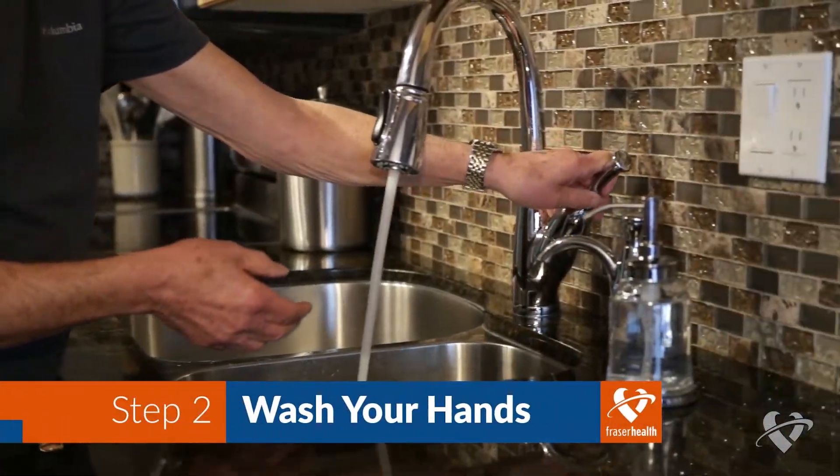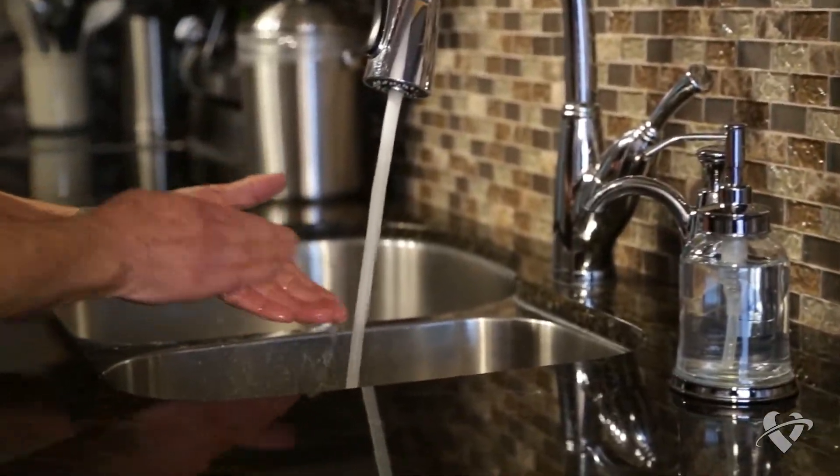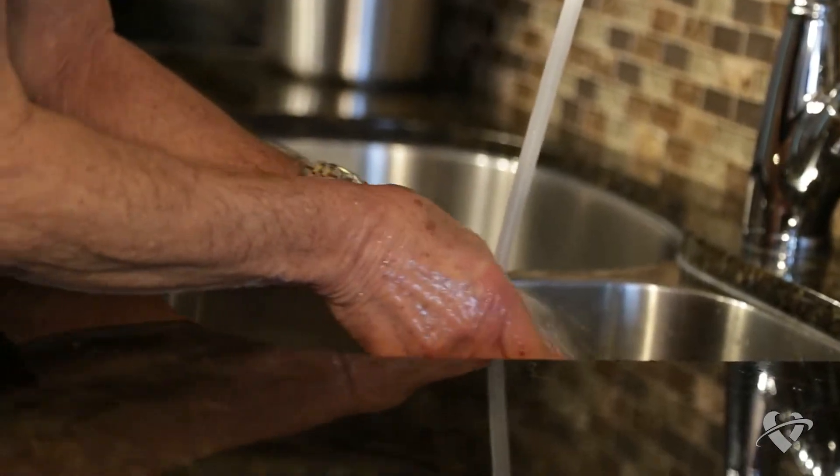Wash your hands before you begin feeding yourself. This will help keep your supplies clean and prevent the transfer of potentially harmful bacteria that could make you sick.